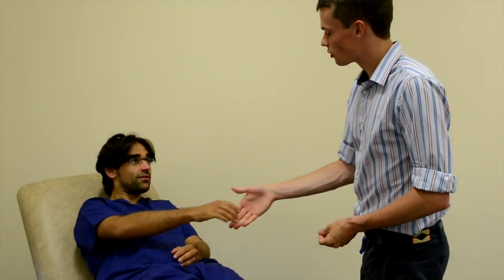Hello, my name's James. I'm a fifth year medical student. What's your name? Kishan. Kishan, nice to meet you. I've come to ask you if it's alright if I could take a special type of blood test from your arm. It's called an arterial blood gas sample. Have you had one of them before? No.